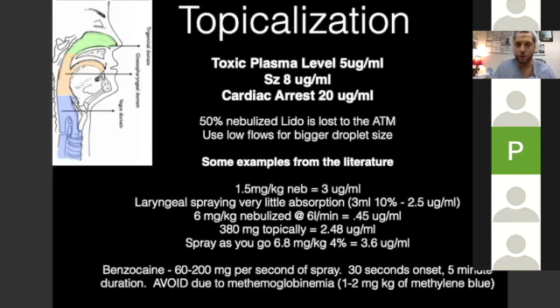Now you also want to prepare the nose. So even if you're planning on an oral intubation, you want to take some Afrin or oxymetazoline and vasoconstrict the nose, because the last thing you want with a difficult airway is to have bleeding. So even if you're planning on the mouth, grab some Afrin and you tell them to point it at the ipsilateral eye, and you make sure they get a real nasty look on their face like they got enough medication, because sometimes it doesn't come out. First shake it, squirt it in air, make sure you have good aerosol, and then do both sides.